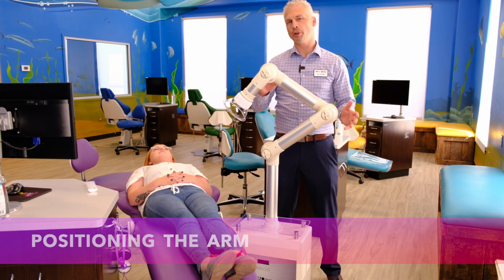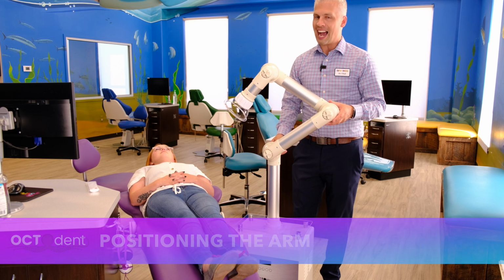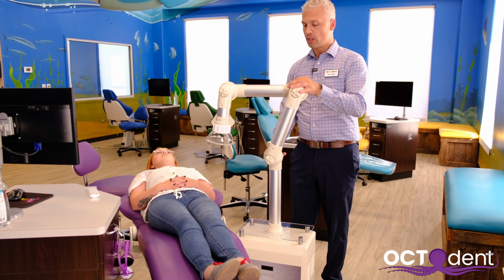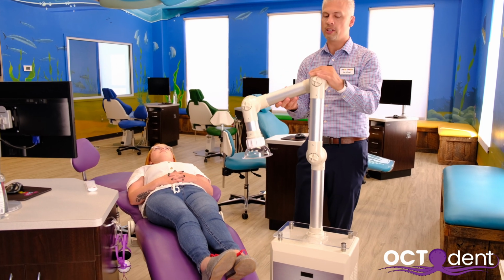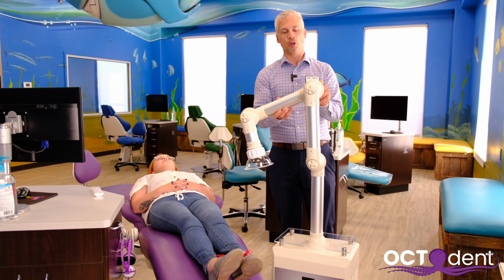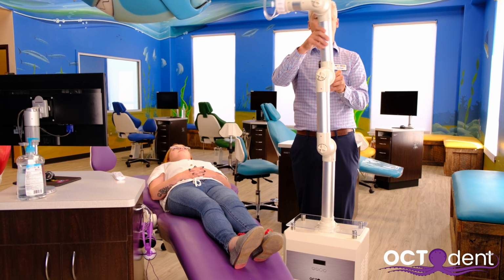We're going to discuss a little bit about the positioning of the arm. So positioning the arm, I don't position the arm. I have my assistants always position the arm. So when I come into the operatory, it's already positioned for me. Whenever it's in storage, I actually have the arm directly pointed up, so that it's the most efficient use of the space in my operatory.